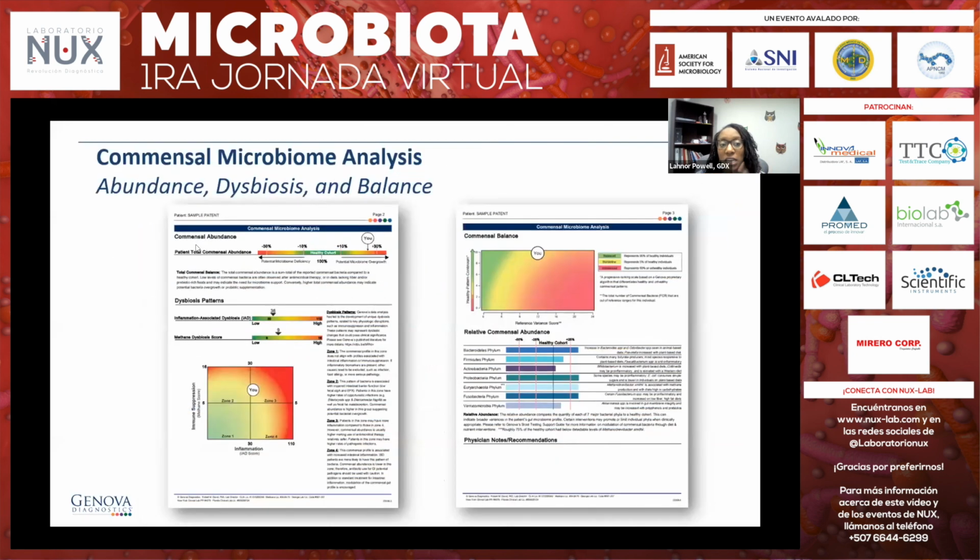So looking at those individual sections a little closer, with the total abundance, it's the sum total of the reported bacteria compared to the healthy cohort. So when we compare you to the healthy cohort, if you have higher amounts, that means that you have a microbiome overgrowth. That could be something as simple as I'm taking a probiotic or I eat sauerkraut every day. It might not be a problem.